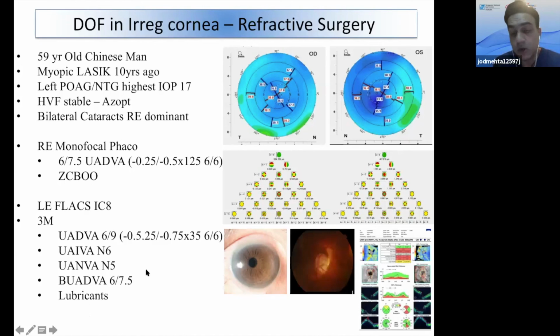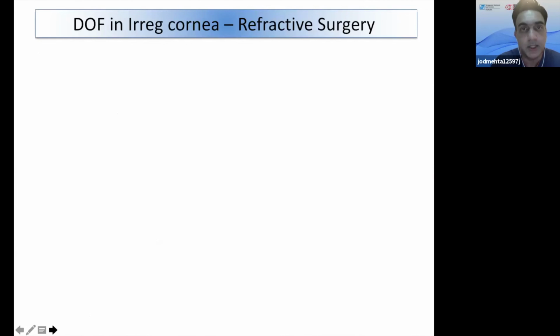He finds he's not so sensitive to the lubrication as basically she was. But the most important thing also is that when I send him to the glaucoma team, they can easily assess his optic disc through that small aperture of 1.36, both with RNFL, visual field, and also with optic disc photography as well, so they can monitor his pressure, which, as you all know, is very difficult to do in people who've had previous LASIK done in the past.